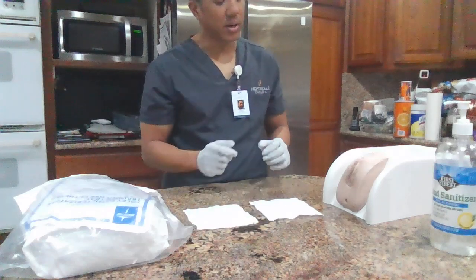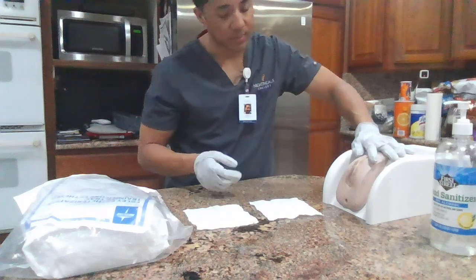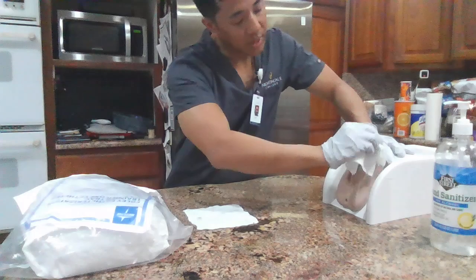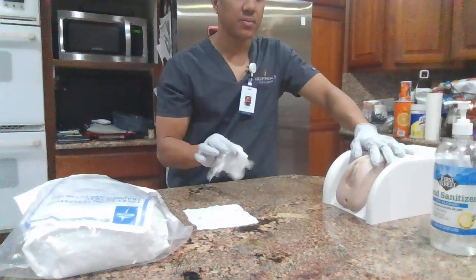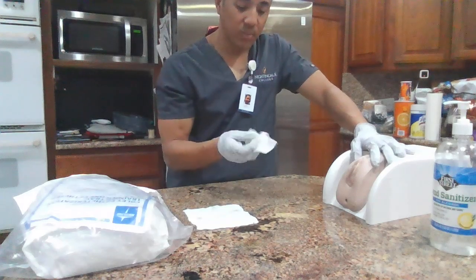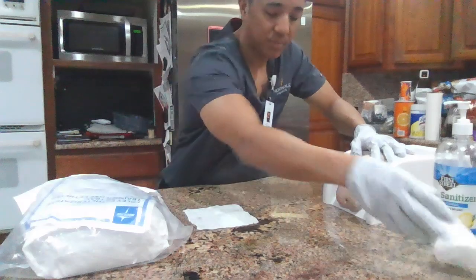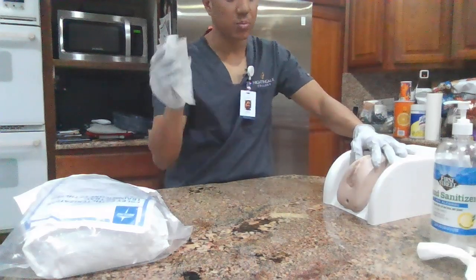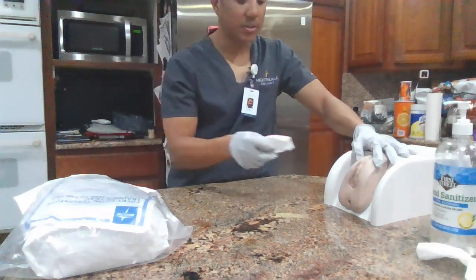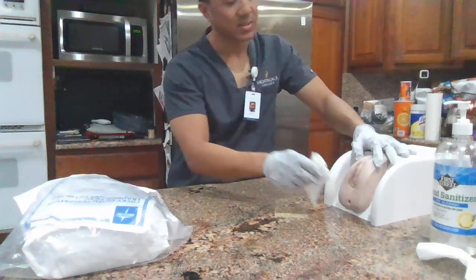So, all right, Mrs. Smith, first of all, I'm going to clean your area. You're going to feel my hand touching around your area right here. Okay, I'm going to take my first wet cloth and wipe from anterior to posterior, far side. And then I'm going to wipe anterior to posterior, near side. And then I'm going to wipe anterior to posterior, meatus. Then I'm going to dry using my dry cloth from anterior to posterior, far side, then anterior to posterior, near side, and then anterior to posterior, meatus.